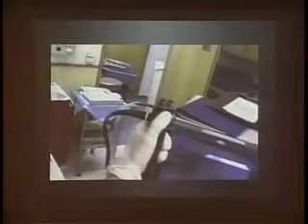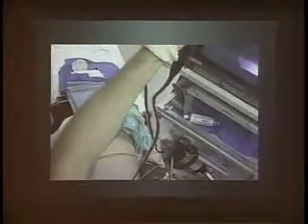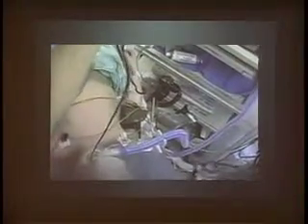Okay. The fiber optic scope's shaft is usually held by the dominant hand. The shaft of the scope is kept straight. The non-dominant hand grips the handle to control rotation, tip to the right or left, and thumb action, tip up or down. Finer adjustments of the tip may be achieved using the dominant hand's thumb and index finger to roll the distal portion of the scope as it is advanced.